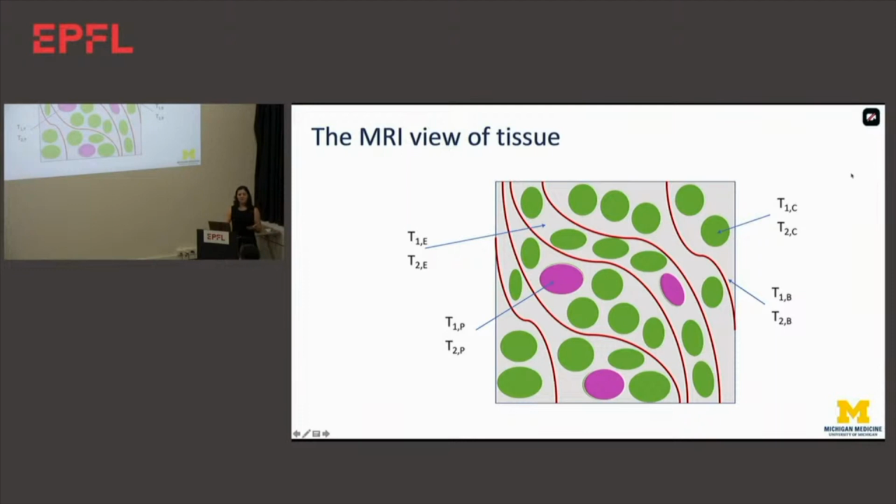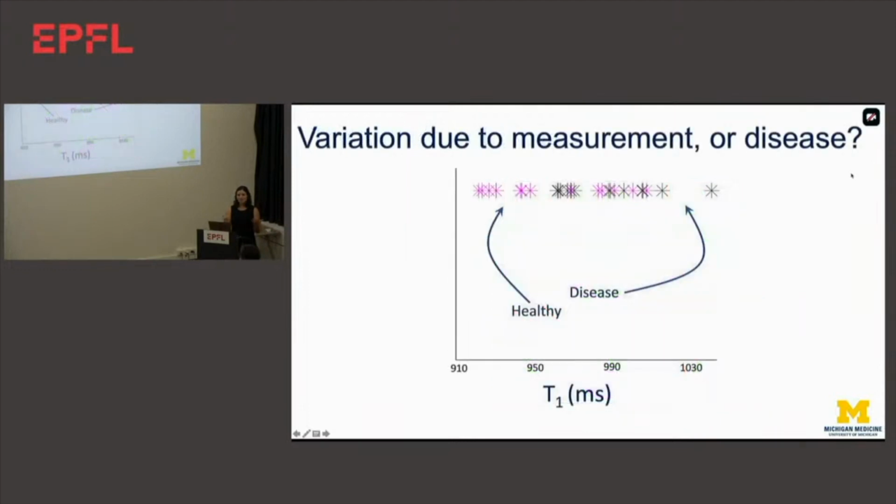And so all of these factors come together and give us a much more muddied picture when we're scanning healthy subjects or patients. It's not quite this nice separation that we'd like to see. And in this case, if we scan somebody, we have no idea what that measurement is going to tell us. And this is, again, why, when we make our cardiac T1 maps, our cardiologists and radiologists only use them as part of a larger set of information, because we have this huge problem.